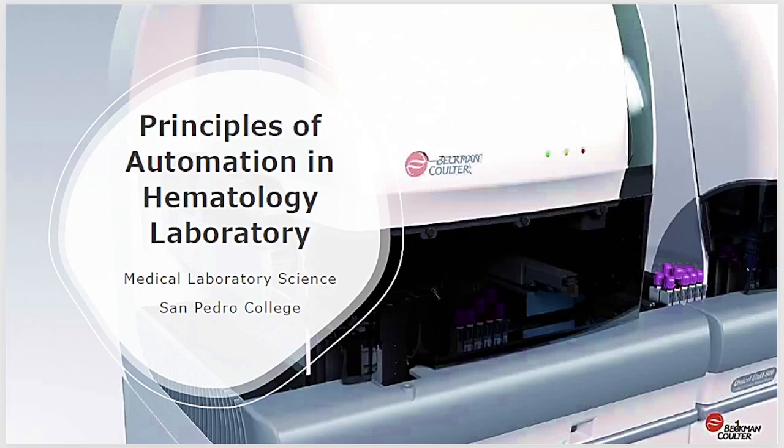Kasi majority of our laboratory right now are using automated machines. Pero there are still some na mga primary laboratory that you still have to perform your manual testing. And also, even if you are using an automated machine, if there's something wrong with your machine, we usually double check it through manual testing. And also, we have naman controls for your automation.